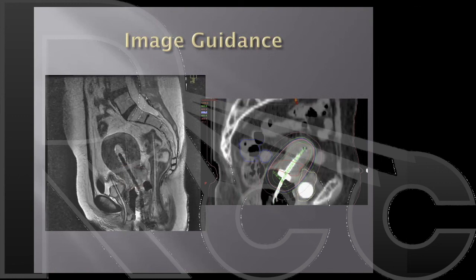With CT, because you can't really see tumor, you can see cervix, you end up prescribing to the entire cervix, and sometimes you actually have to give more OAR dose when you're prescribing to the whole cervix than if you can pull it back a little bit.